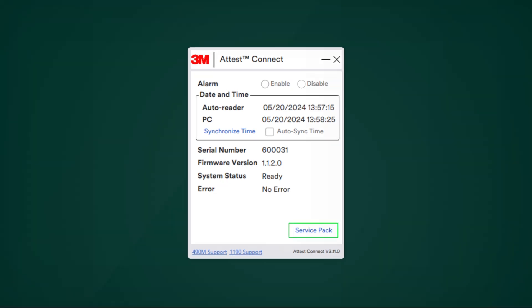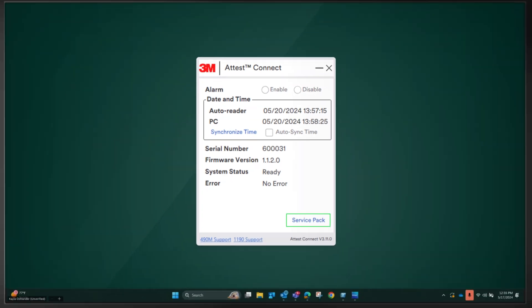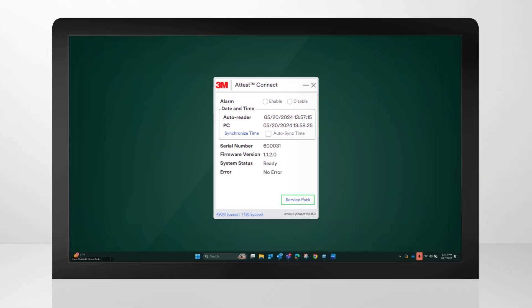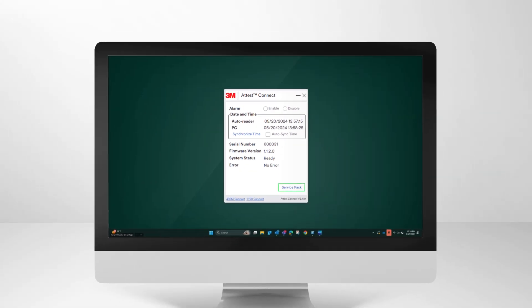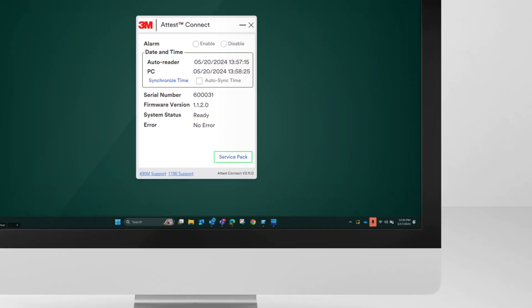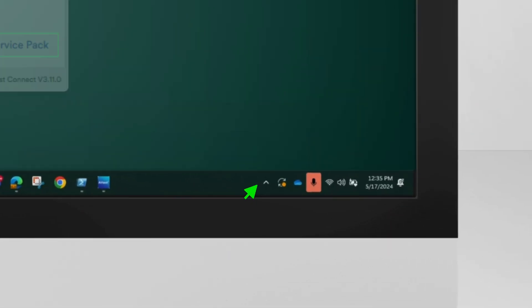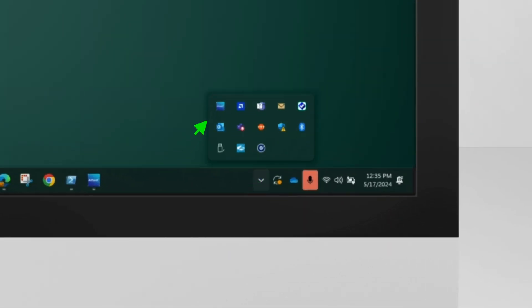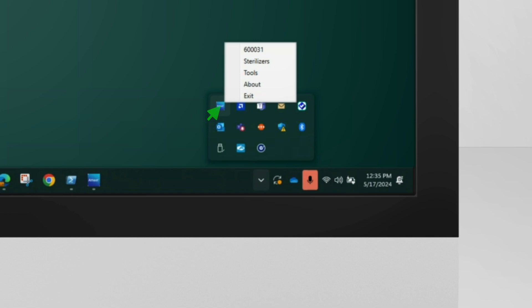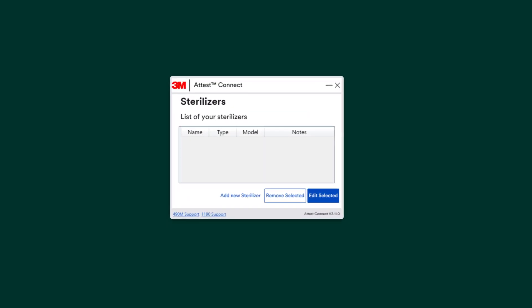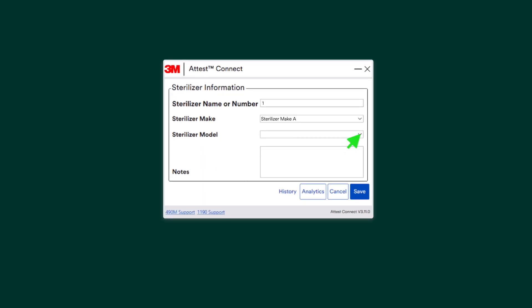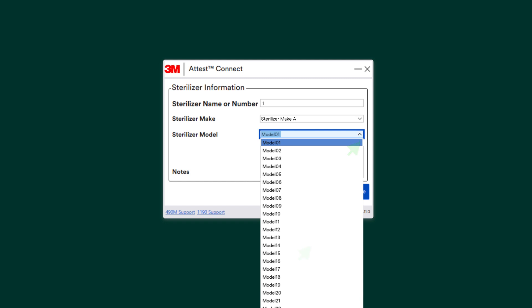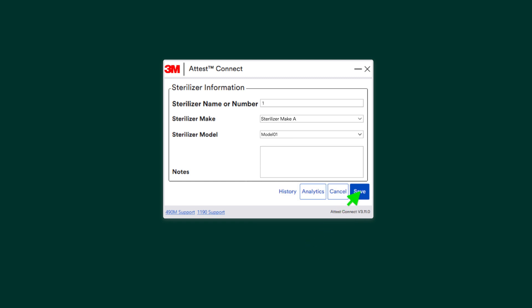Be sure to add your sterilizers. This will help streamline the test card documentation process. To add your sterilizers, open your PC system tray, right-click on the Attest Connect icon and click on Sterilizers. Click on the Add New Sterilizer button, fill out the information fields, and click Save.